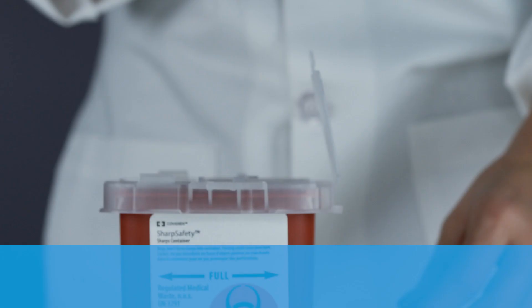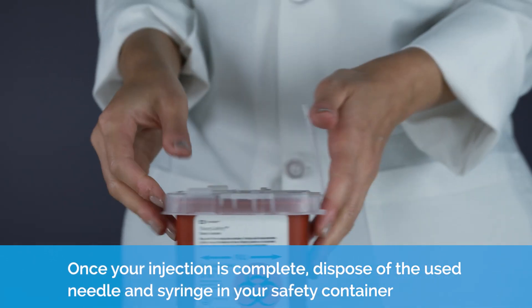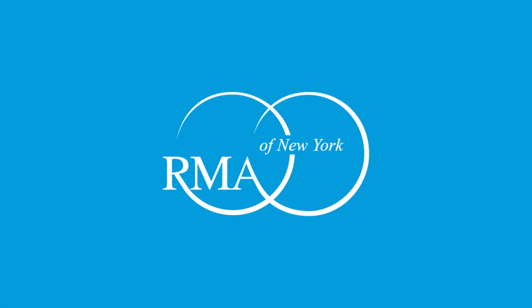Gently withdraw the needle. Once your injection is complete, dispose of the used needle and syringe in your safety container.